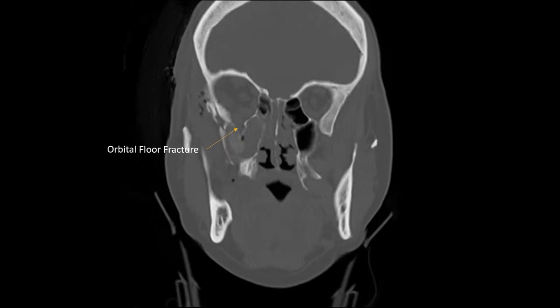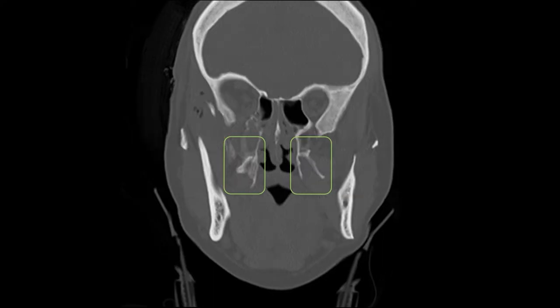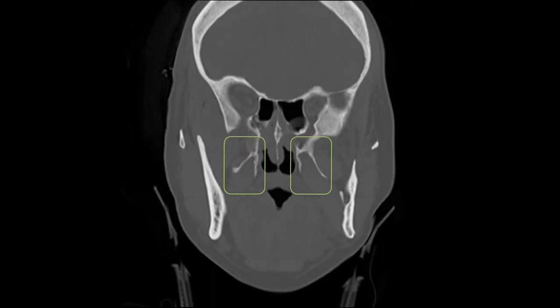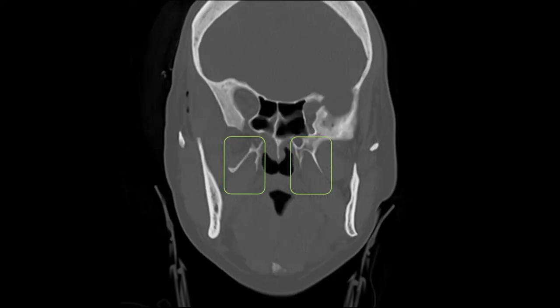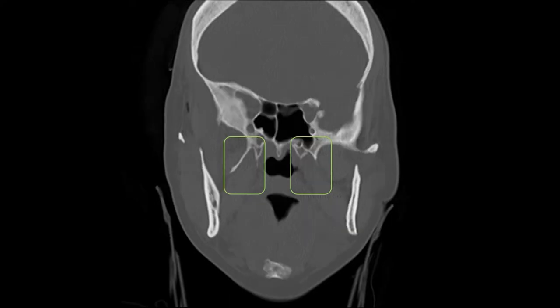Highlighted in green are the pterygoids. It's important to check the pterygoids in the coronal slices as well. You can see that the coronal cuts do not reveal pterygoid plates that have been disrupted. As such, I would expect a stable midface with normal occlusion in the absence of a mandible fracture. This is why I'm calling this an incomplete LeFort 1 fracture.